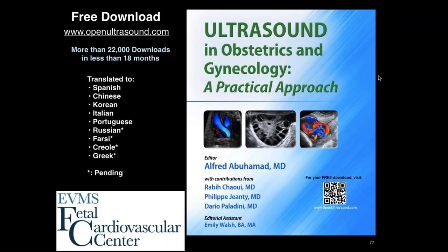And we have done some work here with Dr. Letty, who was our MFM fellow, who did a large study on the ability of ultrasound to detect abnormalities and to assess normality in the first trimester. I think her paper was published in the Journal of Ultrasound in Medicine last year. In patients with large BMIs, above 40, we tend to do an early anatomy ultrasound somewhere between 13 and 15 weeks transvaginally to look at the anatomy at that time.